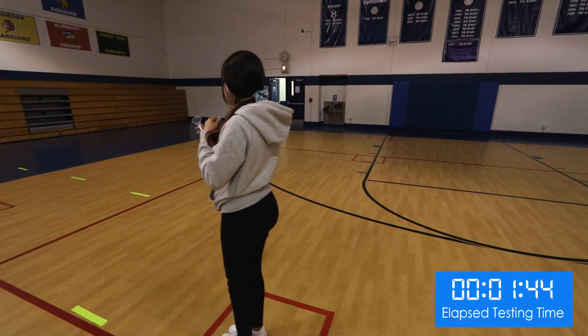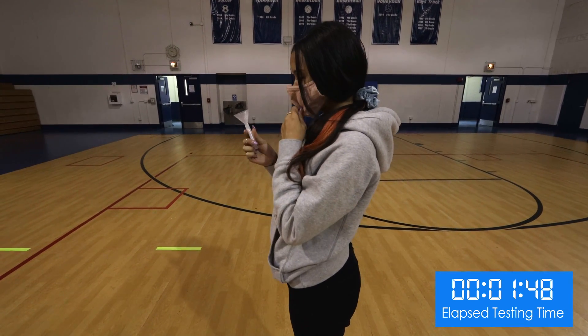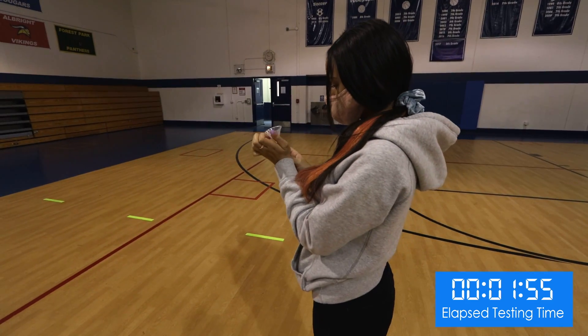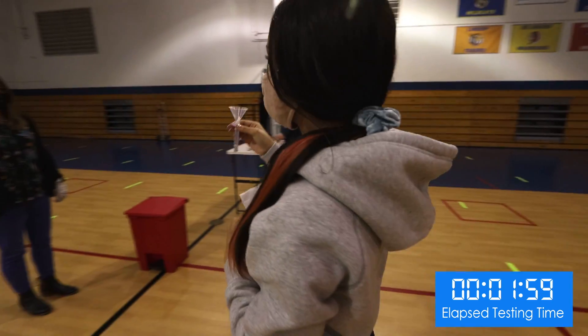She proceeds to a designated area, removes her mask, and begins depositing saliva in the tube using the funnel. She taps the side of the tube lightly to settle any bubbles and raises her hand once her saliva reaches the fill line.